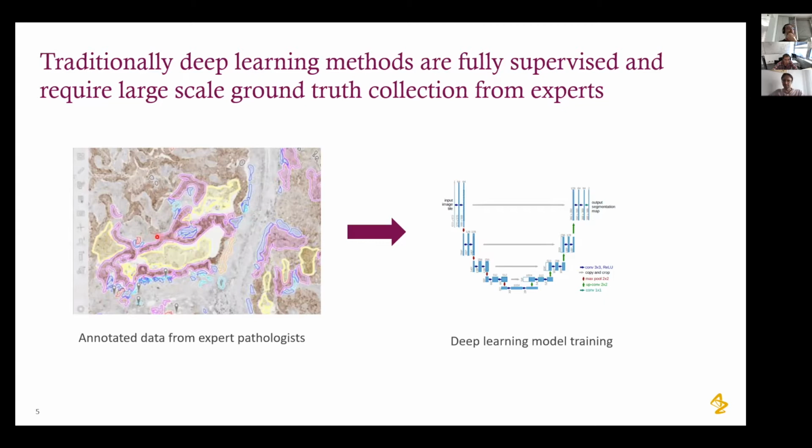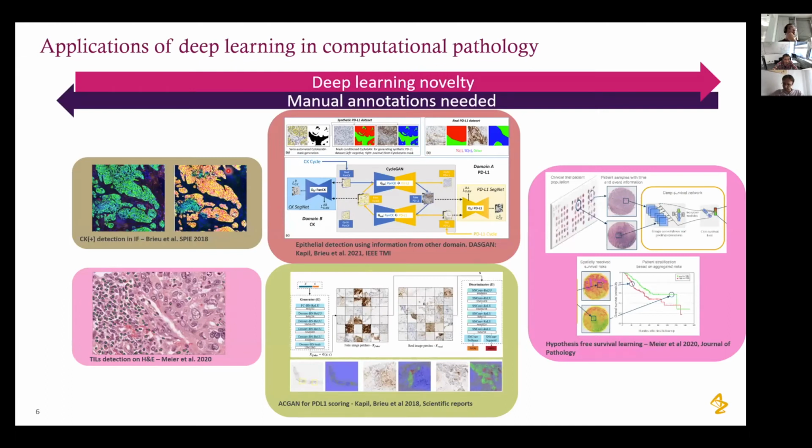As you can imagine, we would need an army of pathologists and experts to draw these kinds of regions on different kinds of images and cells. So this is our baseline, where we come from, and we want to improve on that. We want to reduce this dependency on pathologist annotations, and that's why we try to develop new methods here in AstraZeneca to reduce this demand for annotations, as well as at the same time make the methods faster and have a more robust analysis.